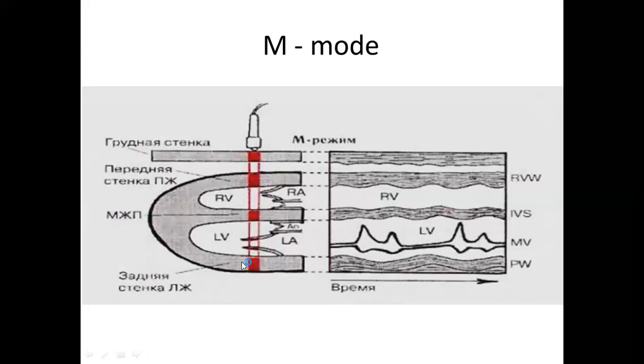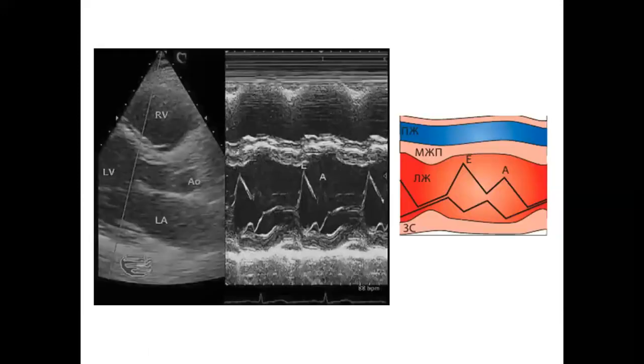So during systole, the mitral valve is closed, and in the atrium we have diastole, and the blood is flowing from the pulmonary veins into the left atrium right here, while we have this phase of the M mode, and the aortic valve is open. So this M and W-like appearance of the mitral valve is normal.